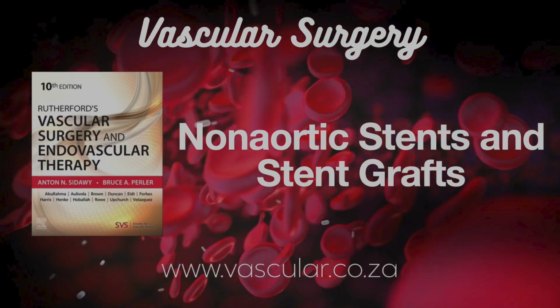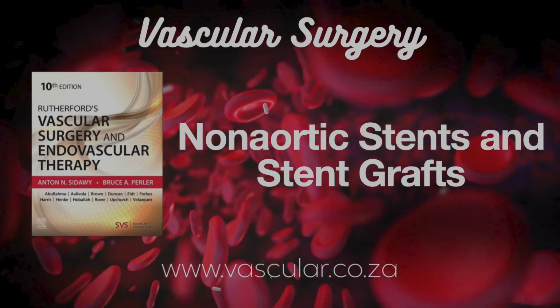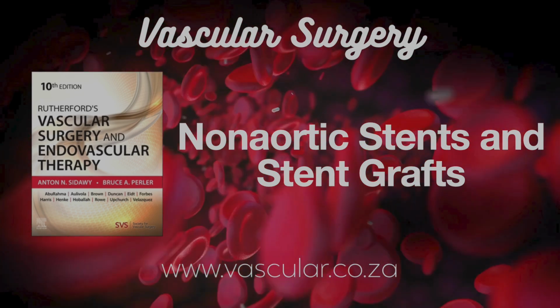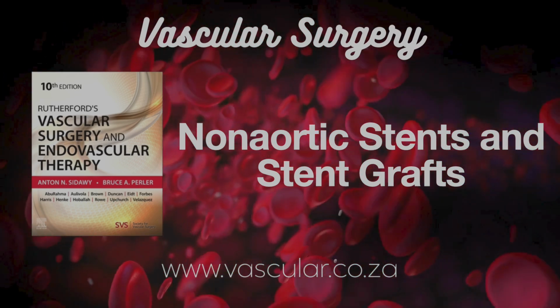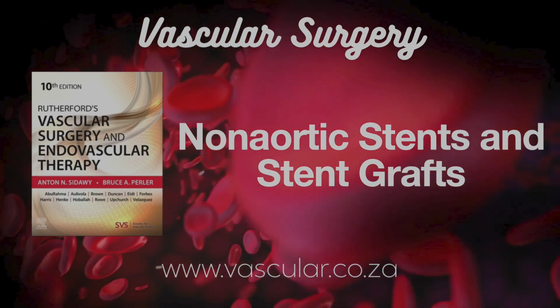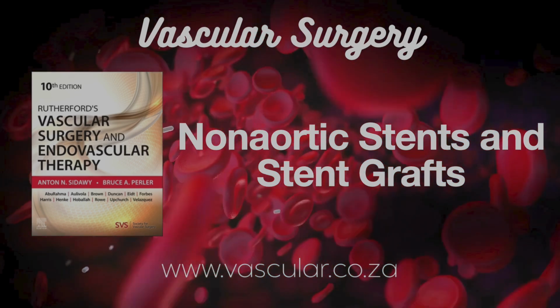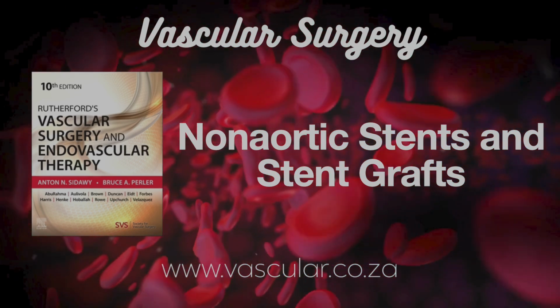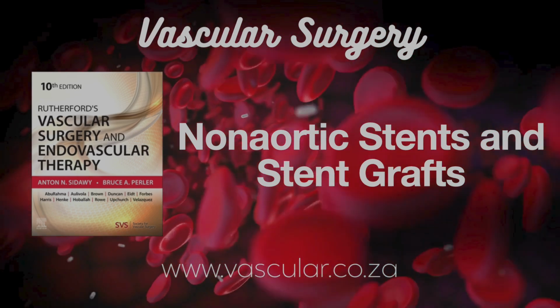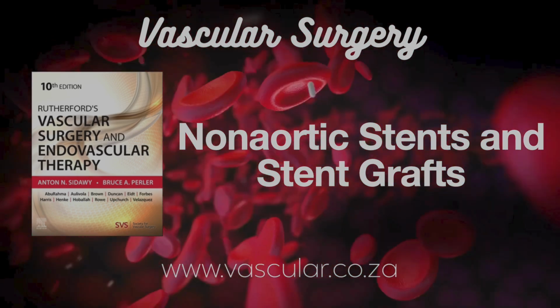How aggressive are we talking? Well, the numbers are pretty stark. For coronary angioplasty, the chapter mentions restenosis in like 30 to 50% of cases. Wow, that's almost a coin toss. Pretty much. And similar failure rates, sometimes hitting 50%, in renal, iliac, leg arteries too. It really limited how useful angioplasty was compared to surgery back then. So clearly, just pushing it open wasn't enough long-term.